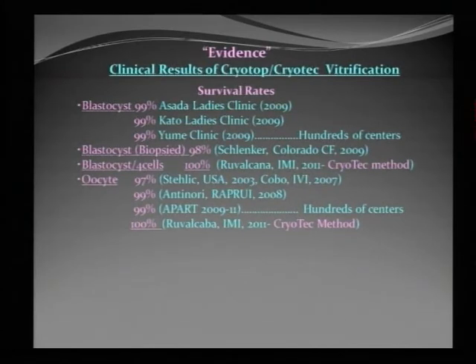Schoolcraft is the main embryologist of the Colorado Center for Fertility, and this center is very famous for the cryoloop. Michelle Lane, who has now moved to Australia, and David Gardner were the directors here. They used cryoloop. However, cryoloop doesn't work for the human oocyte.